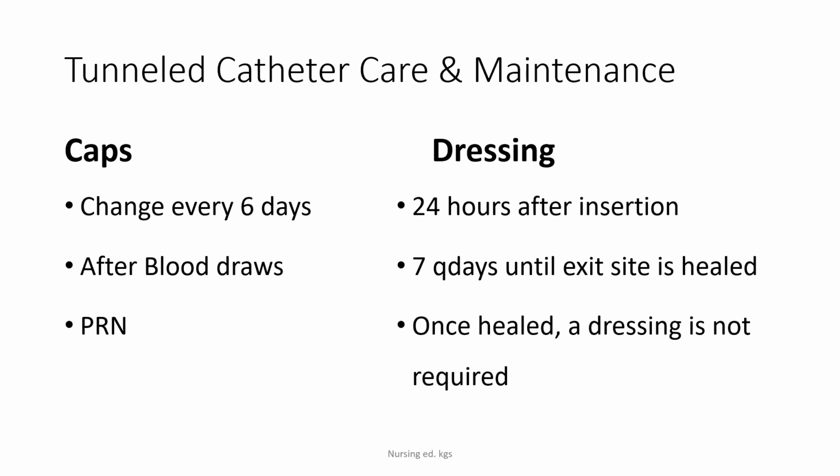Another important factor to point out is that these insertion sites should be monitored for signs of infection, including redness, warm to touch, or purulent drainage. And if, as the nurse, you notice any of these, you are going to consult with the physician so that the patient can be evaluated and treated appropriately and promptly.